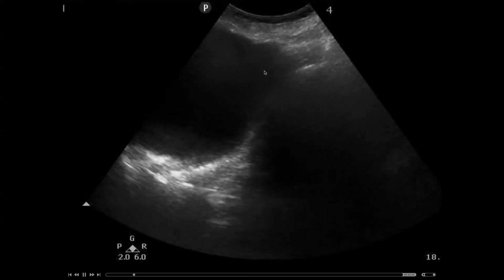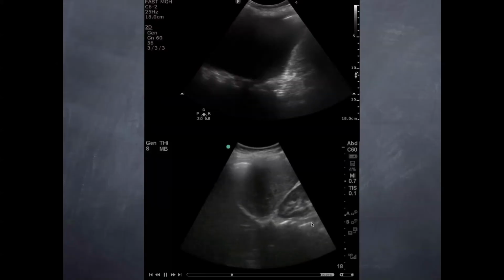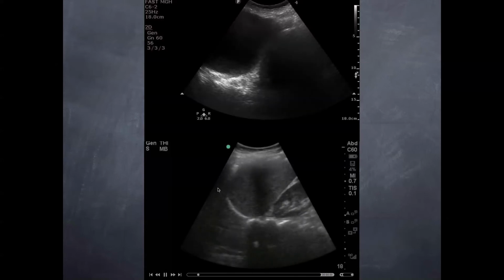When we did lung ultrasound, though, we found a very impressive positive finding, which was this, a very large pleural effusion. If you remember the first image I showed you, you should see the spine disappear and you have the diaphragm curve up like so.